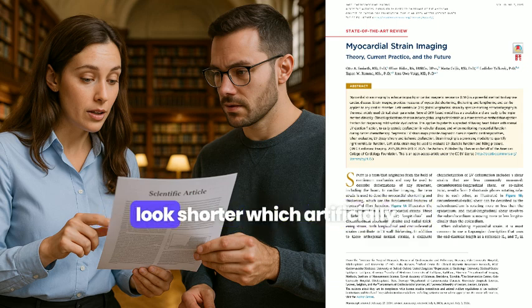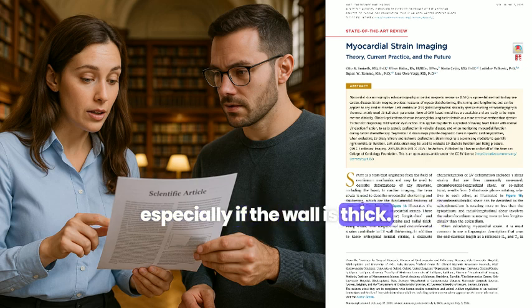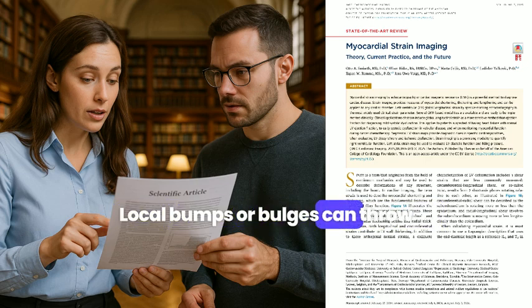Foreshortening makes the ventricle look shorter, which artificially increases the GLS value, makes it look better than it is. So technique matters. Hugely. Also, ROI placement, make sure you get the full wall, not just the endocardium, especially if the wall is thick. Local bumps or bulges can throw off tracking too.